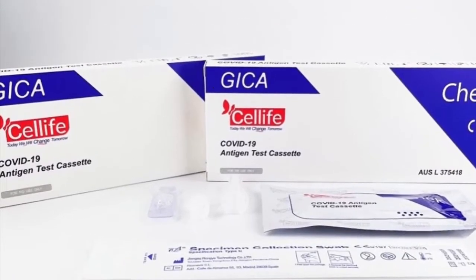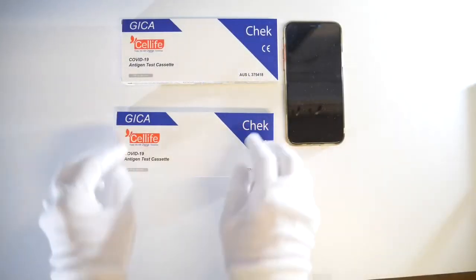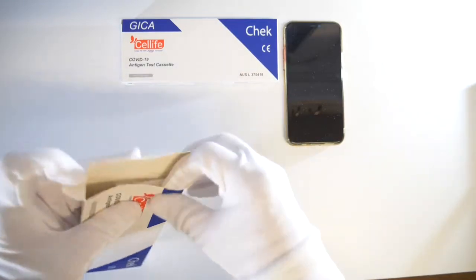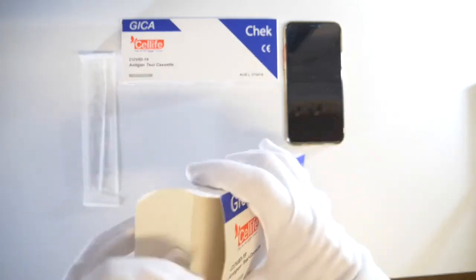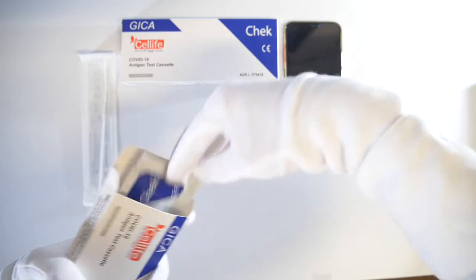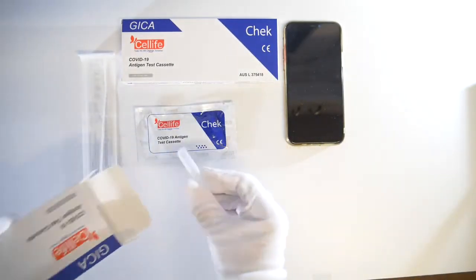Cell Life Australia introduces our new COVID-19 antigen test cassette. Our easy-to-use kit contains a sterilised swab, a test cassette, and an extraction tube containing the buffer solution.